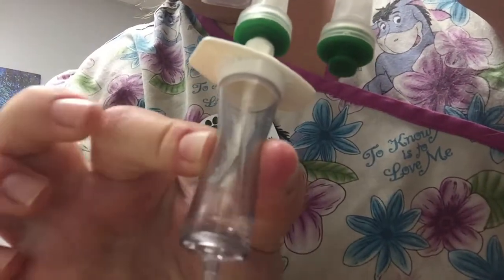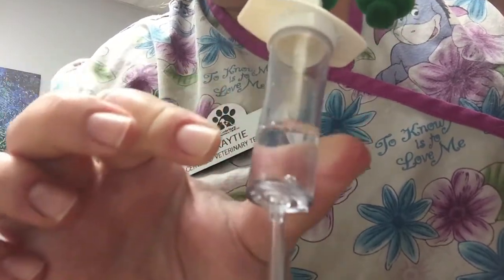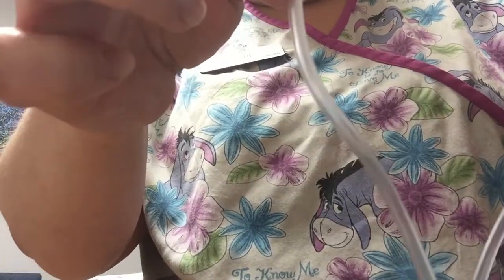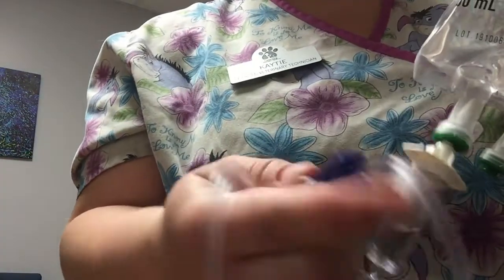Flip it up and squeeze it so you get a little bit of fluid in there — that's going to keep bubbles out of your line. Then roll the clamp up so you can flush the line. Wait until the fluid gets to the bottom of the line, and then close it off.